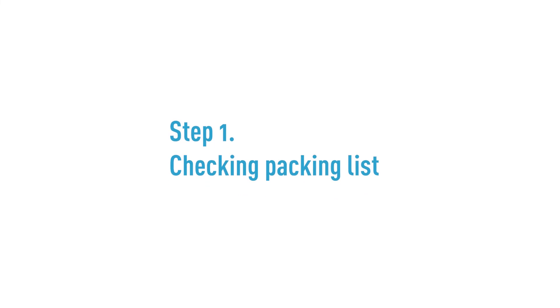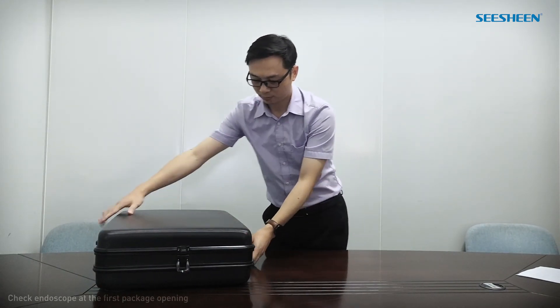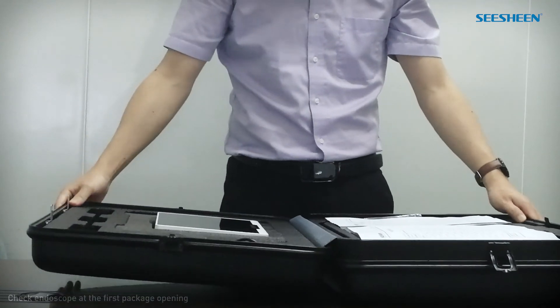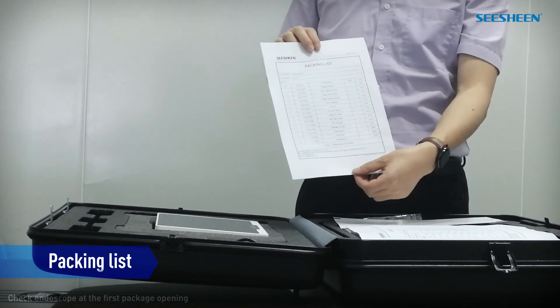Step 1: Check packing list. Open the suitcase and you will find the packing list. Check all parts and accessories according to this table.